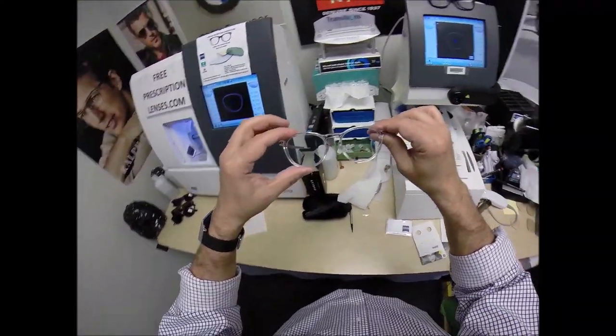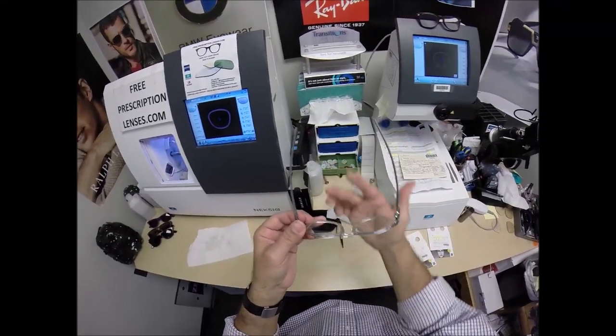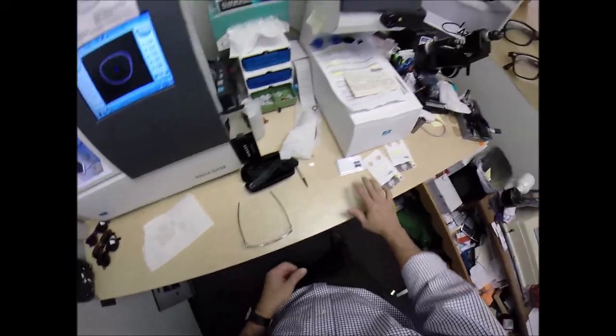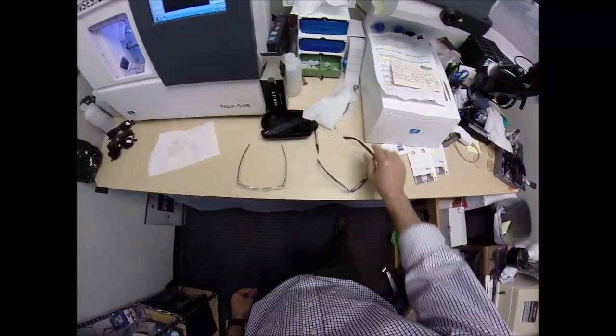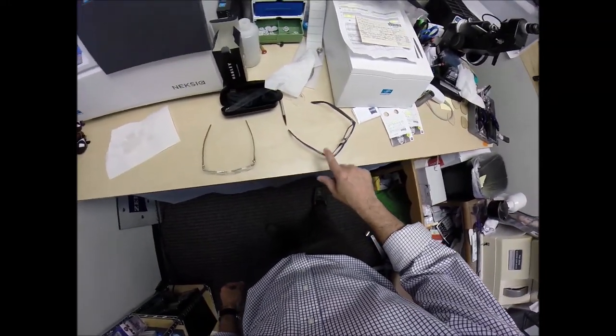But I'm going to get them in standard alignment first, also known as a three-point stance. The three points are one, two, and the bottom of the frame being three. I set them on the counter and press down. There is no wobble. Now, when I take off these spatula temples and I press down, they wobble on the counter, but they sit level on me.